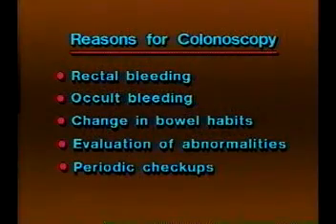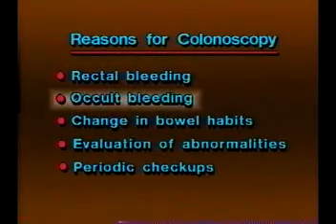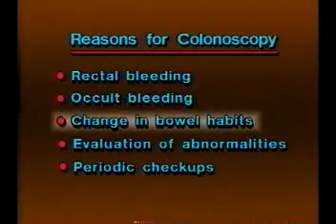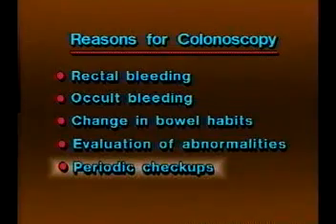A colonoscopic examination is performed to investigate the cause of any of several symptoms. These include obvious rectal bleeding, occult or hidden blood in the stool, or a recent change in bowel habits, such as persistent constipation or diarrhea. Colonoscopy is also used to evaluate abnormalities which have shown up on other tests, such as a barium enema, and for periodic checkups of patients who have a previous history of colon cancer or polyps.